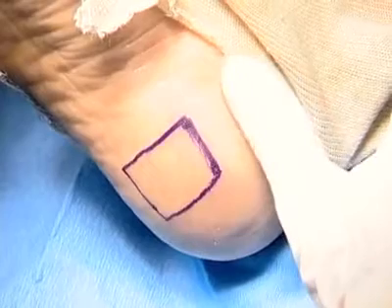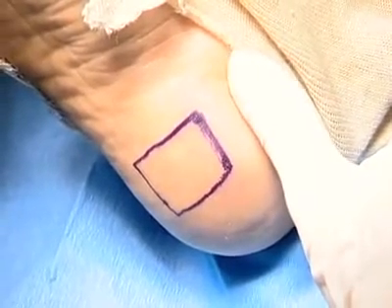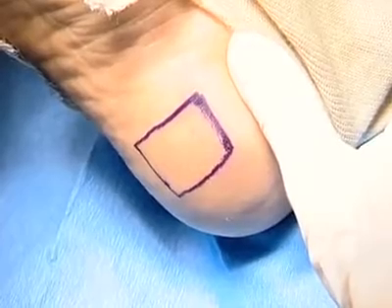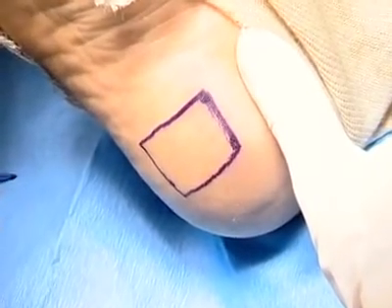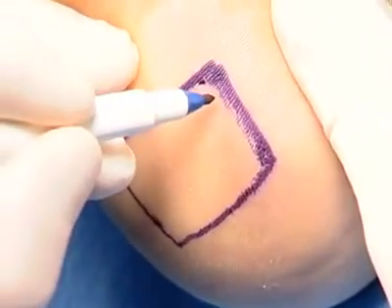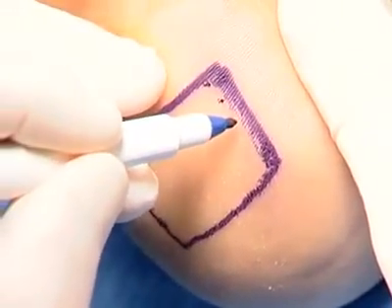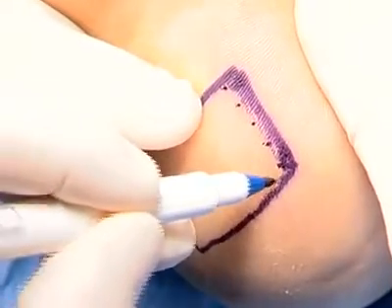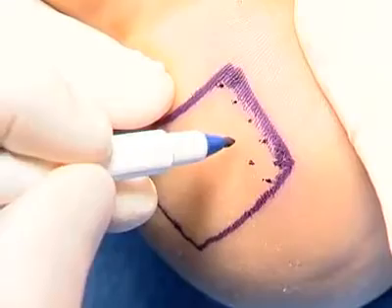Prior to the induction of intravenous anesthesia, we have mapped out the area of pain as described and felt by the patient. At this time, we are now mapping out the area where Topaz will be performed. Dots are made approximately 5 millimeters apart to fill up the entire area of pain for the area that will be treated.